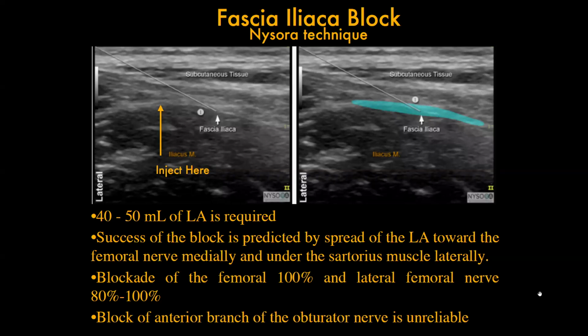So I come in the room, I give them a little something to relax. I put the probe on, I put 40 mLs in this technique, and then I put them on their side and put the spinal on them. And that way, they're going to have a much better night. These are patients prone to delirium, so if you can avoid opioid exposure, it's really good.